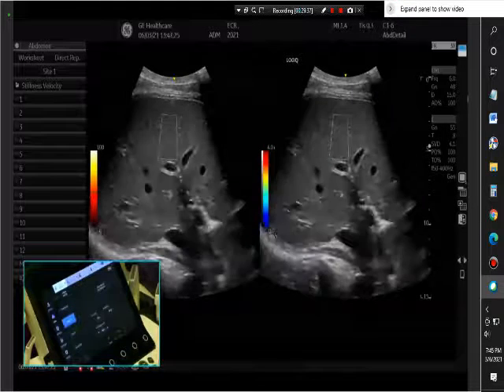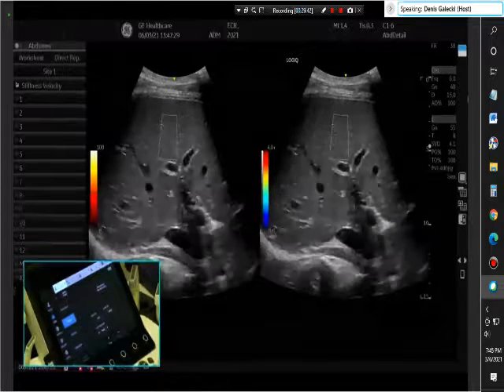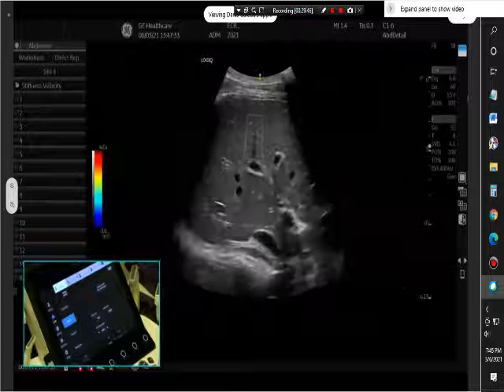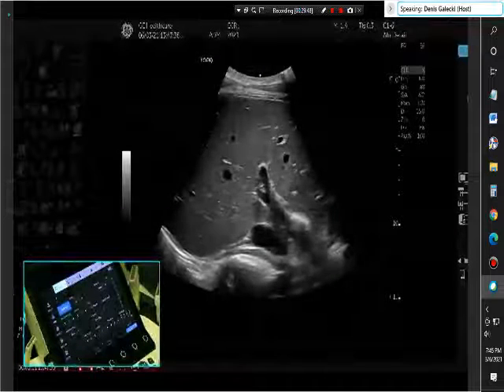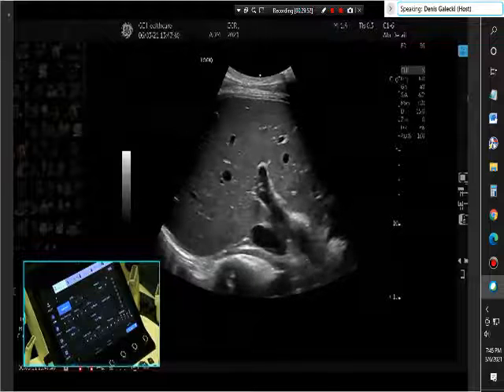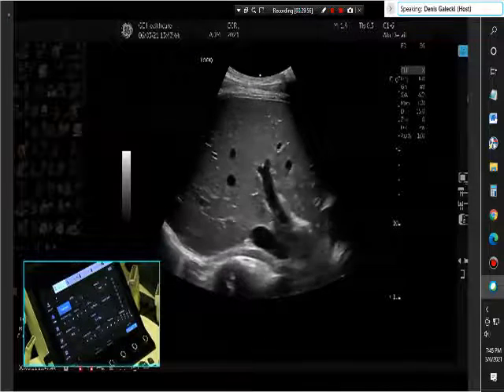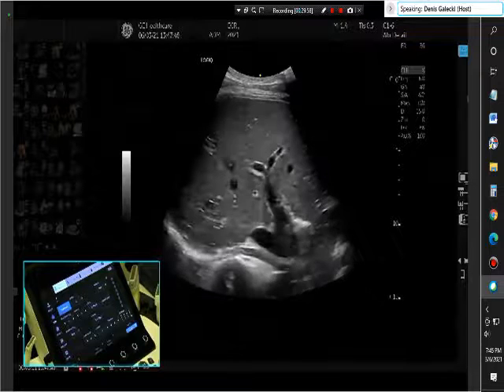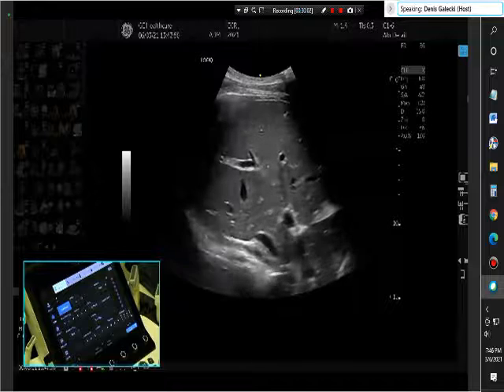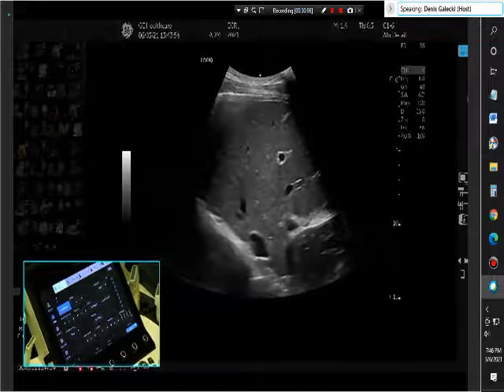Let's move to ultrasound guided attenuation parameter. UGAP is a real-time image-guided method to quantify the attenuation of the sound wave in liver tissues due to steatosis. The preparation of the patient, as well as the concise workflow, is very close to the shear wave acquisition we just went over. I will now activate UGAP.